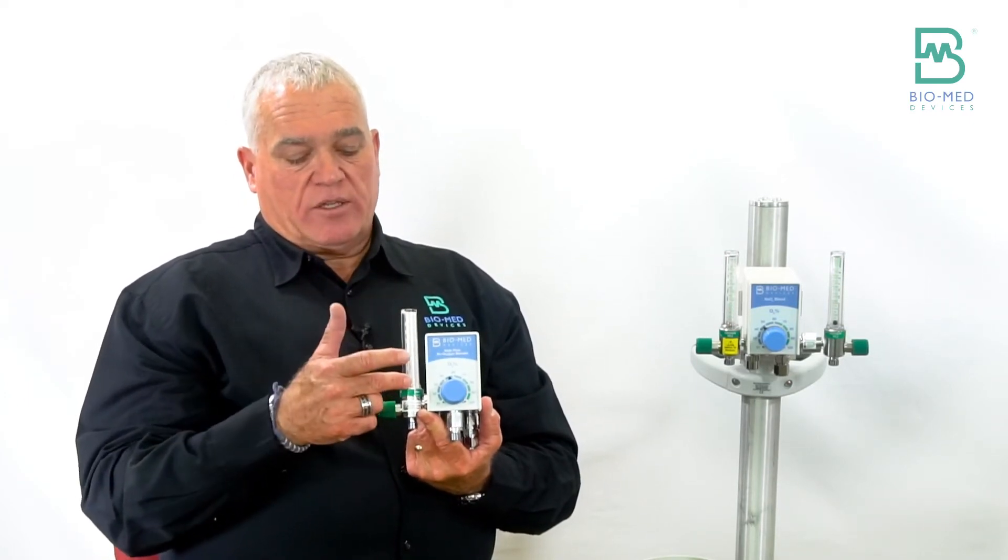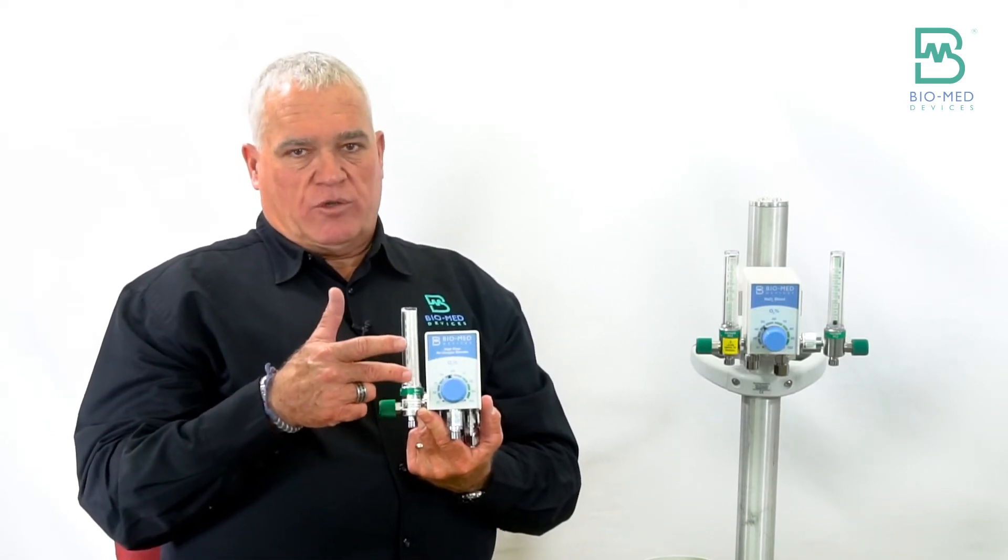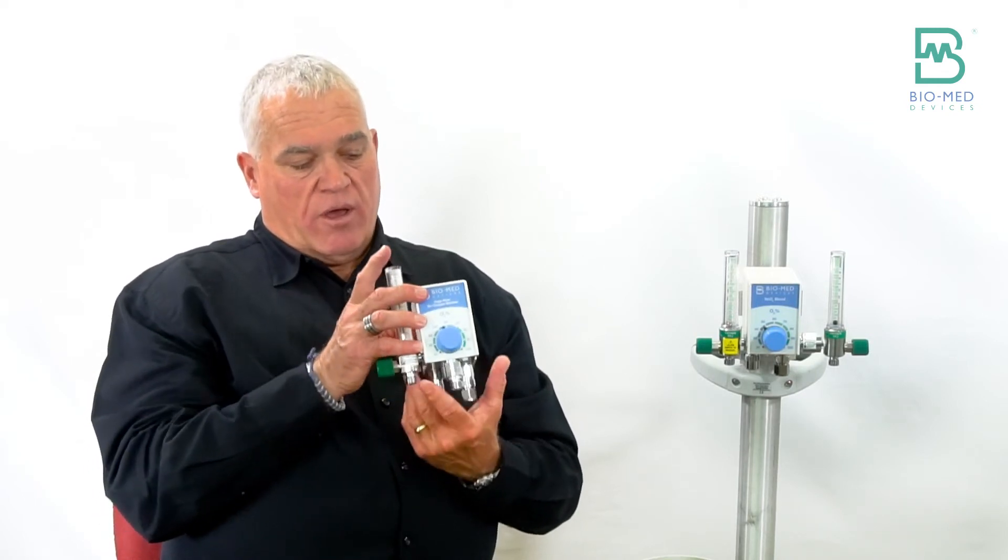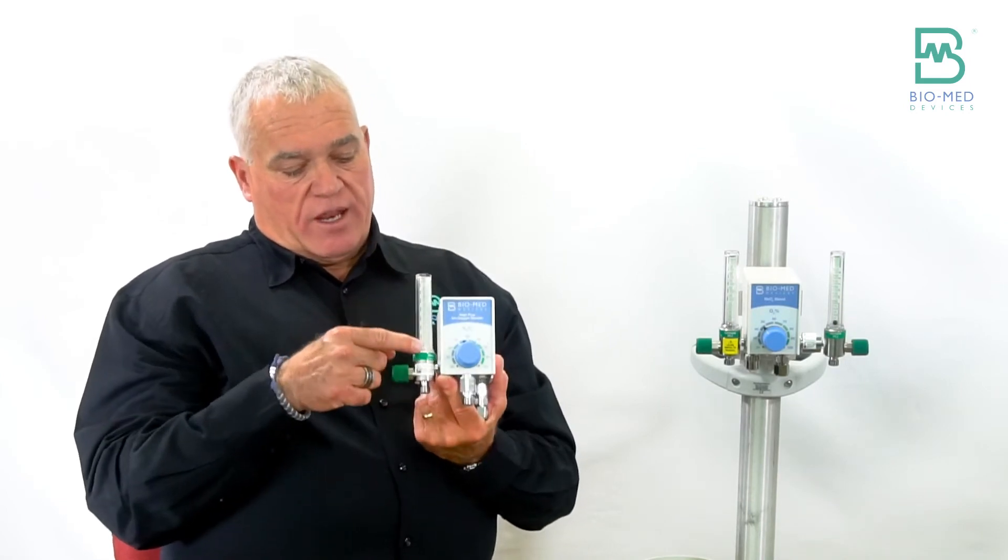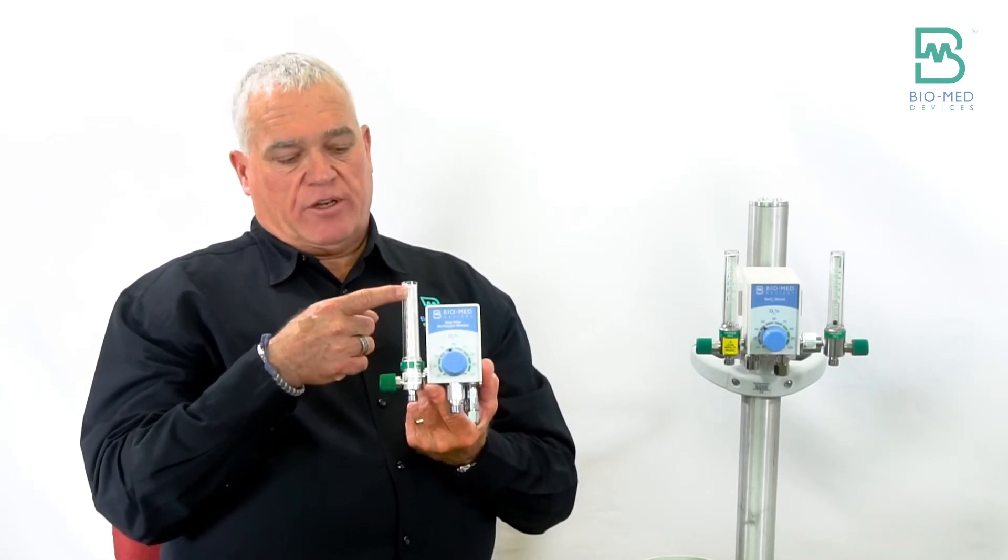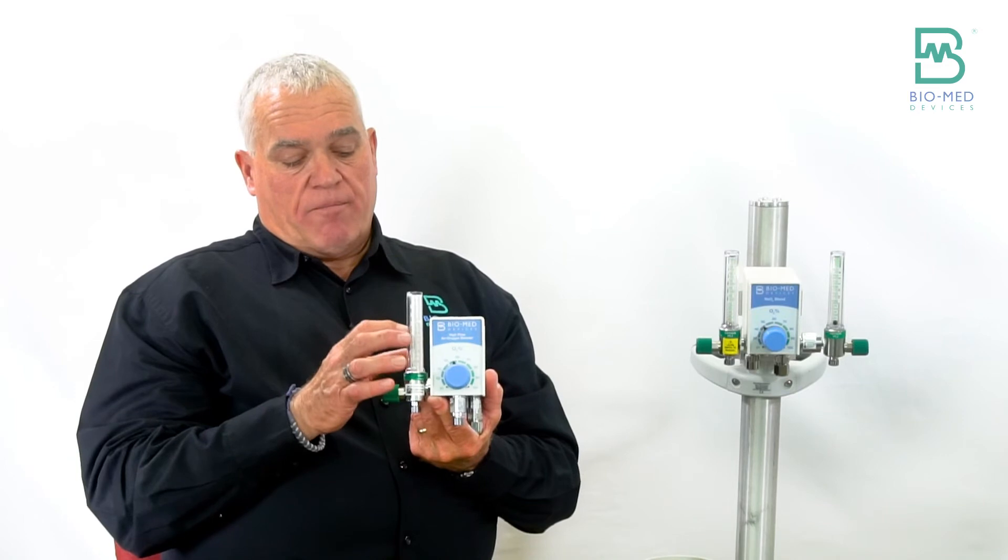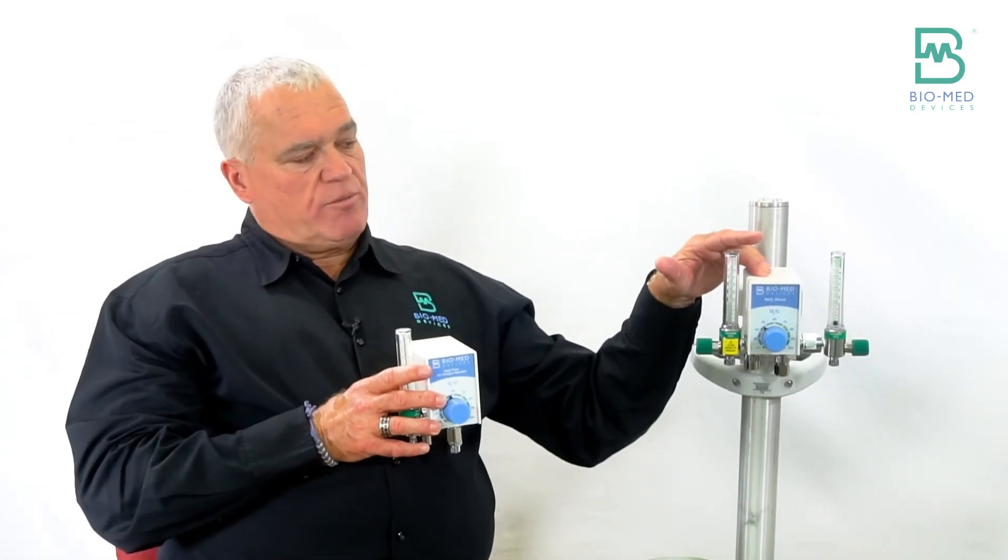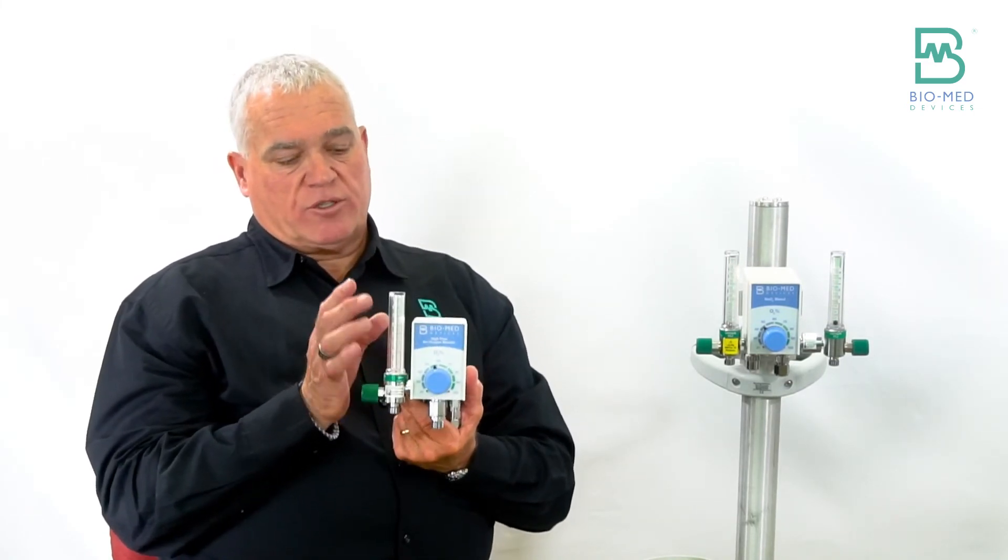In that case, we might want to deliver flows to a patient with a high flow nasal cannula up to sixty liters a minute. So we have our 2002 F70D that has a zero to seventy liter flow meter hard mounted to the side, so we're taking up a lot less space and you can dial those flows. A low flow blender has a maximum output of thirty liters a minute, whereas the high flow will output up to 120 liters a minute.